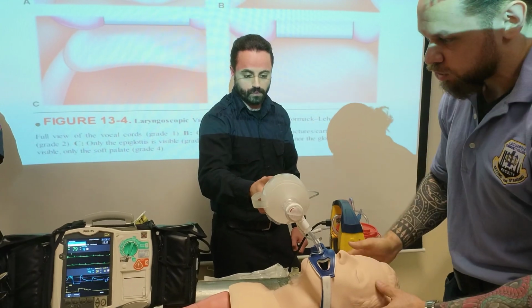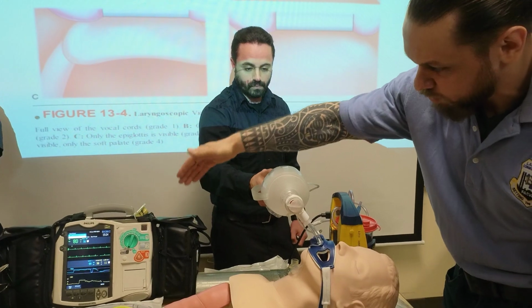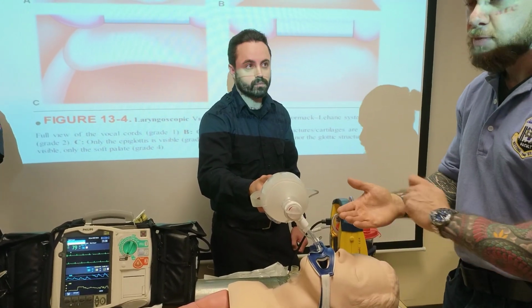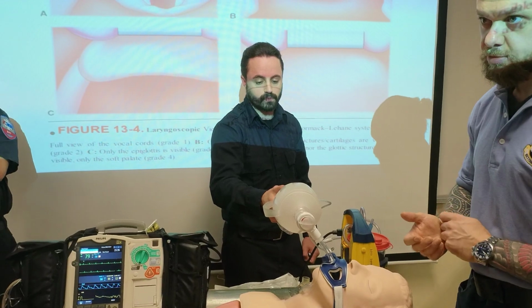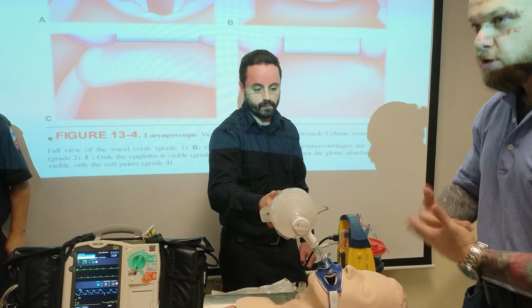Dr. Smith, while he's on our stretcher, we transferred him. Pulse ox reads 99. End-tidal CO2 is this number, and this is the strip. Can you please sign? I put Dr. Smith at the bedside of the transfer. If he doesn't sign, I will write the name of the doctor, and my partner will witness it. Okay. Because it's very hard to go and argue in my report.